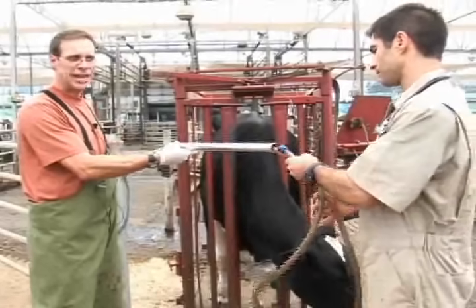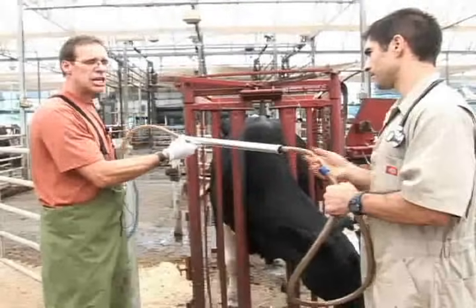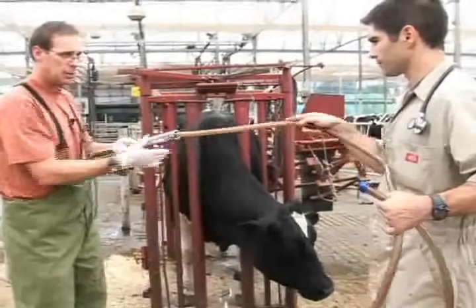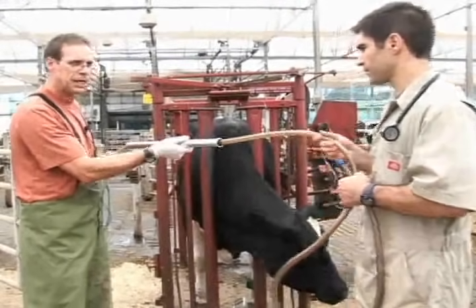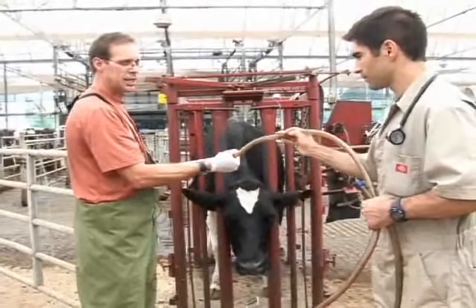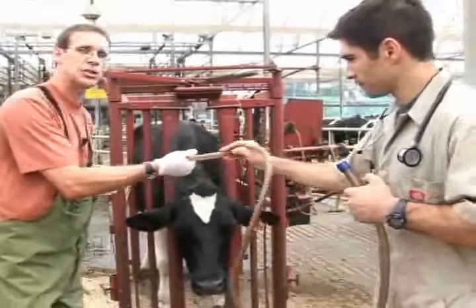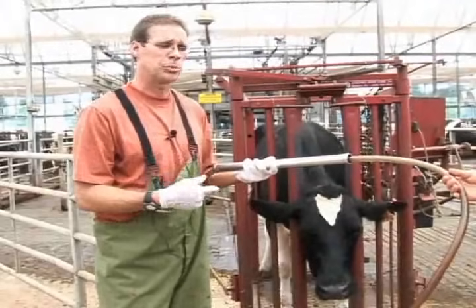When you continue the tube down, there's going to be resistance. The esophagus allows for resistance. If the tube is in the esophagus, the person passing the tube will meet resistance and feel very clearly that they're up against the wall of the esophagus as they're sliding into the animal. That's your second good checkpoint that you're passing through the esophagus and into the rumen.